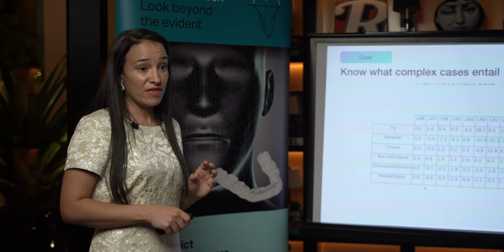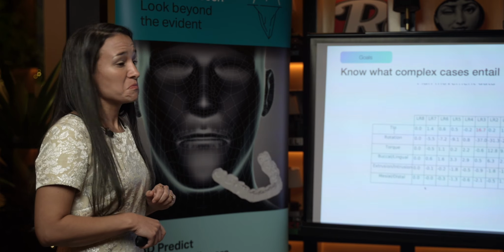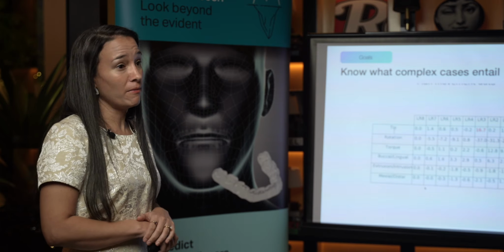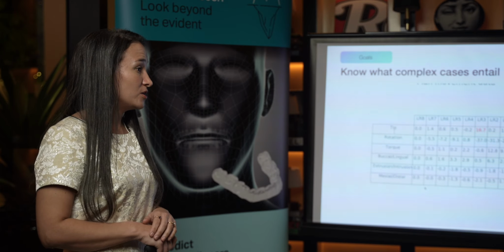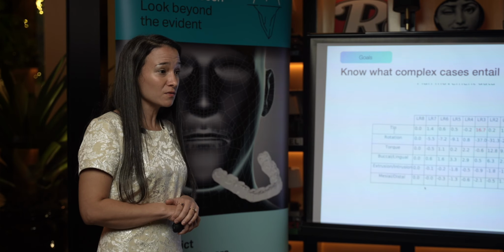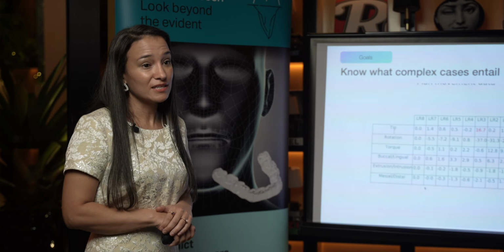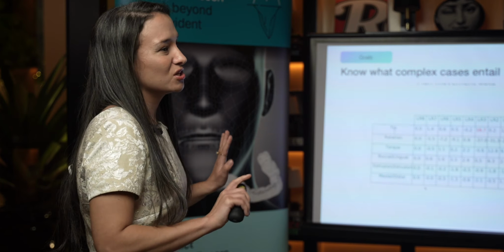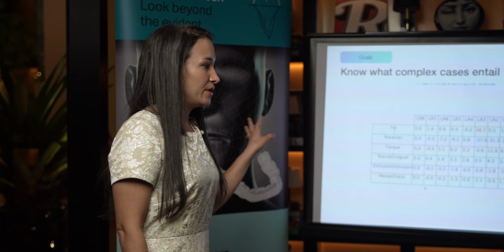Yes. Within predictable limits? No. Is it just gonna take 22 aligners like you said? Probably no, probably it's gonna take double. Is your patient willing to go to 3 years or more of treatment without burnout? That's a conversation that needs to happen. So the doctor at the end said, no, this is just too much for me. I don't wanna deal with it.